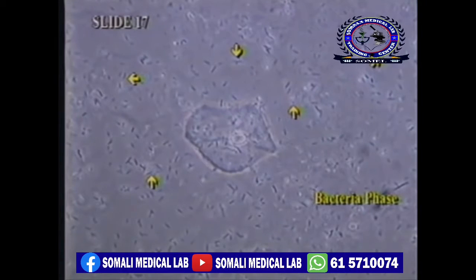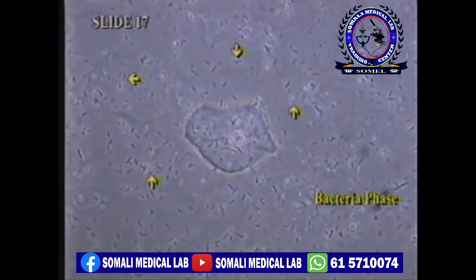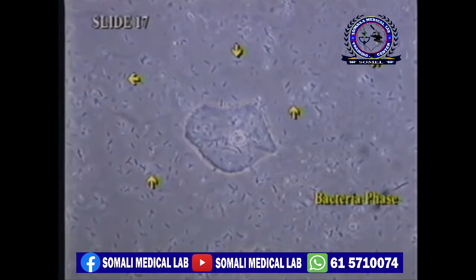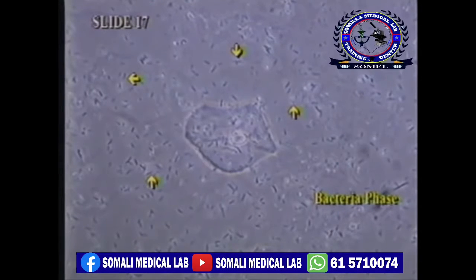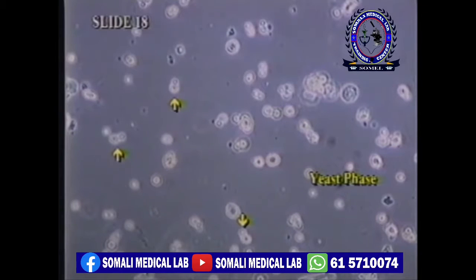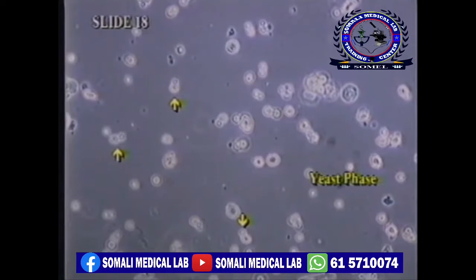Something that might look like amorphous material, if you are not up close and careful, is bacteria. In this slide, we see a significant amount of bacteria under high power phase. A few of these are refractal, like very small amorphous crystals. Another microorganism seen in urines is yeast. As you can see from this slide, it is sometimes difficult to separate yeast from other elements.